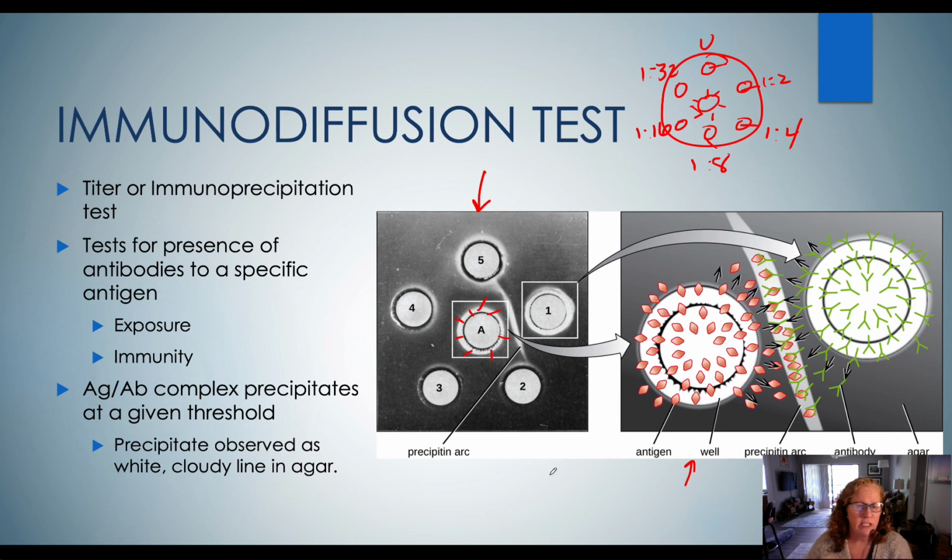And what this really means in numbers is if my patient has 100,000 antibodies in this 10 microliters of their serum, then technically my next dilution should contain 50,000. Right? So this should have 50,000 antibodies in it. And this one should have 25,000 because this is 1/4 the number of antibodies as the undiluted. So the idea is that we just continue to dilute the patient's serum.